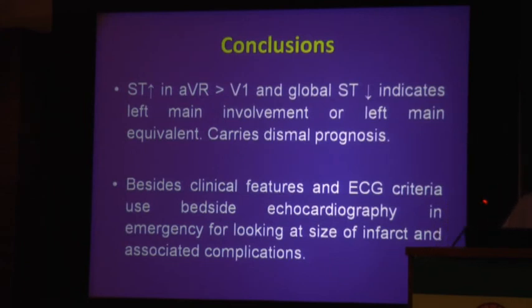And I would in fact like to end here by saying have bedside echocardiography, because you should have echo in the emergency room, because it's going to tell you about complications of acute MI, it's going to tell you about the size of infarct, so many more, or what is the fluid status. If you look at the inferior vena cava, you will know how much fluid you can administer. So echo is another important gadget in your armamentarium which will help you manage your patients of acute myocardial infarction better. Thank you.